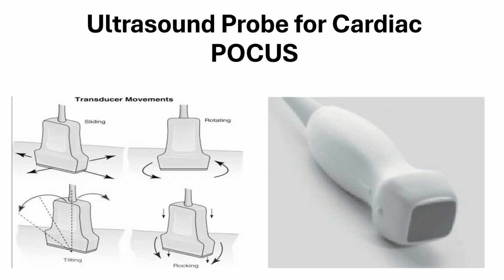There are different probe manipulations which are important for us to understand. First, ultrasound probe sliding is usually self-explanatory, but means moving the probe along the surface of the skin or tissue. Next is rotating the probe, which means that we turn the probe around its central axis without moving it along the surface, such as in sliding, for example.